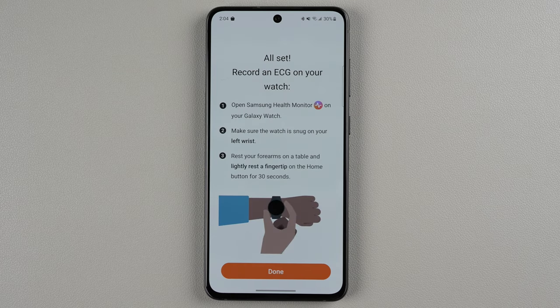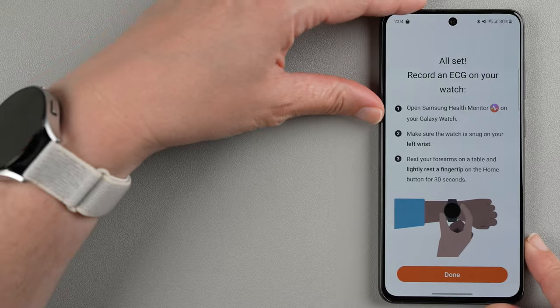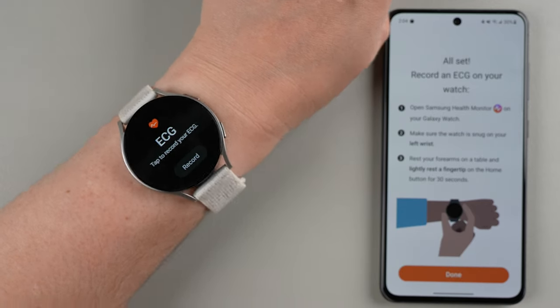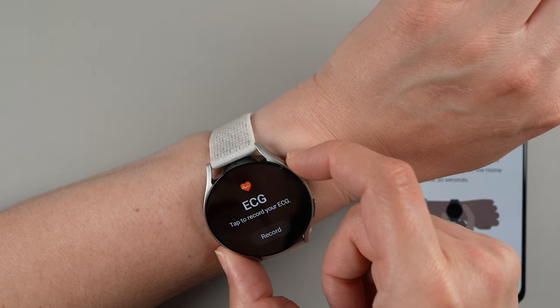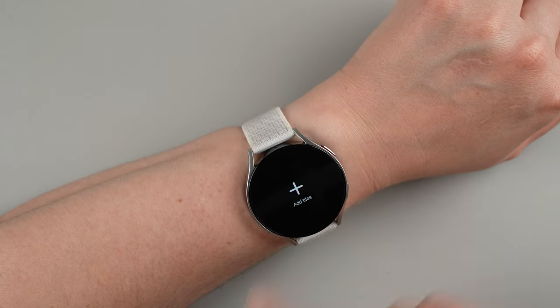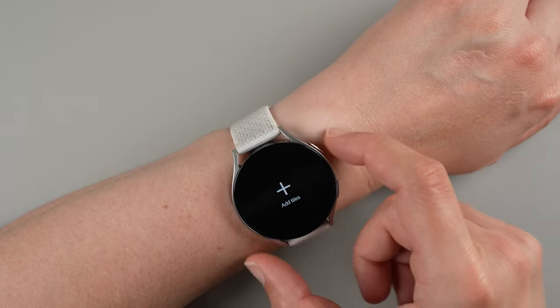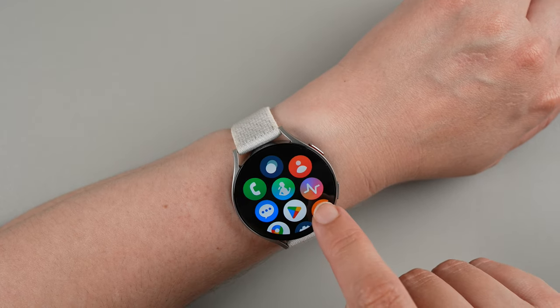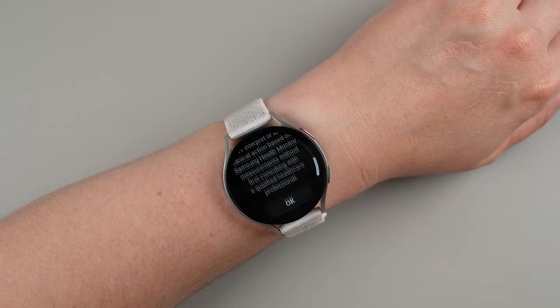We're all set and we can record an ECG on the watch. It says open the Samsung Health Monitor on your Galaxy Watch, make sure the watch is snug on your left wrist, rest your forearms on a table, and lightly rest a fingertip on the home button for 30 seconds. I'm going to see if I can do this on the screen for you. I think we could go to this tile here — it says tap to record your ECG. If that's not in your tiles, you can swipe to the end and tap here to add the tile. Otherwise, you can swipe up from the bottom and look for the health monitor app, which is this icon — tap on that and it guides you through.